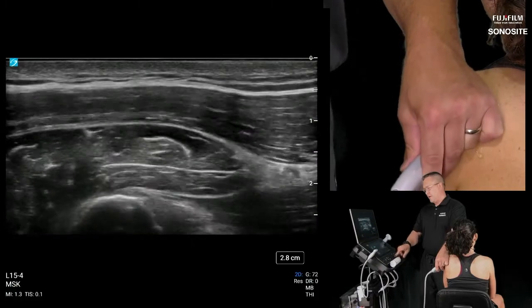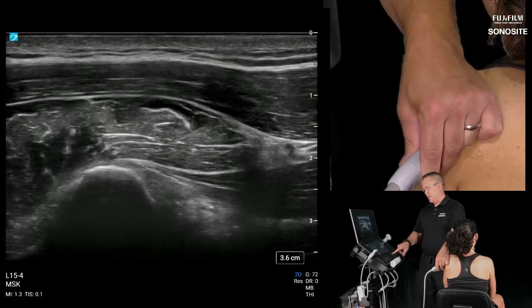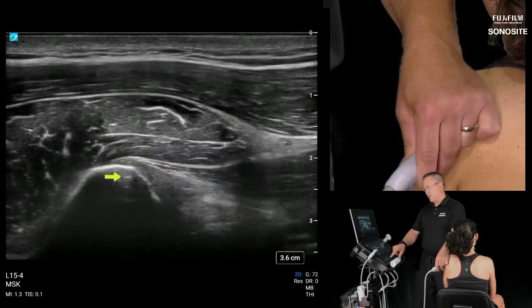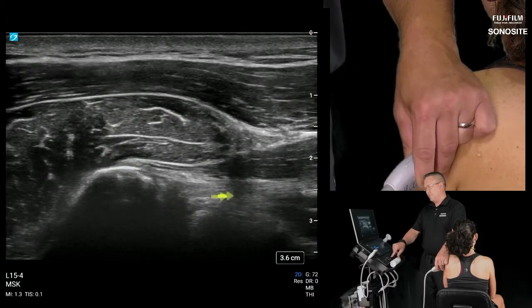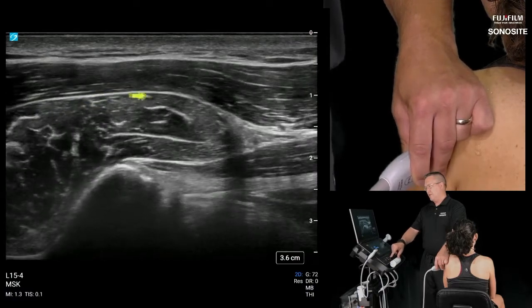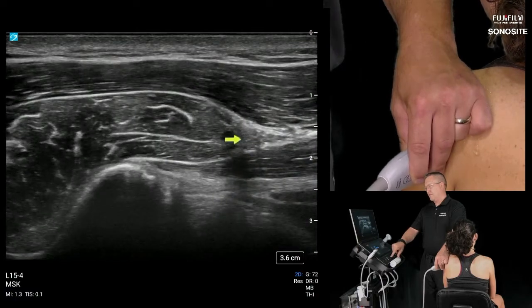There we go. Our next skeletal reference point just went down in depth a click, and bringing up the arrow is the inferior glenoid. So at this point, the inferior glenoid tubercle is the insertion of the long head of the triceps. This makes a really pretty view. So here's the triceps. This is the muscle belly of the teres minor. And you can see a little edge artifact casting a shadow here.